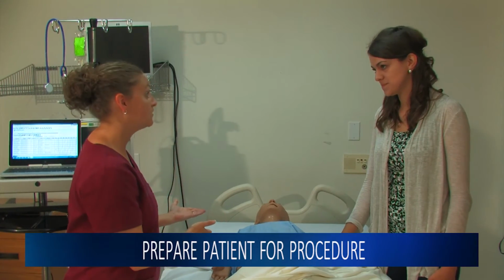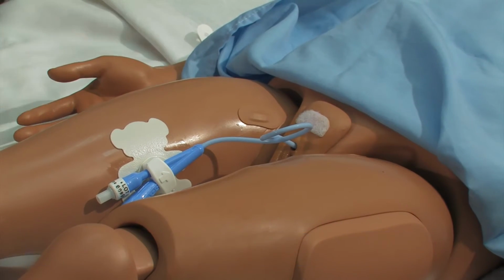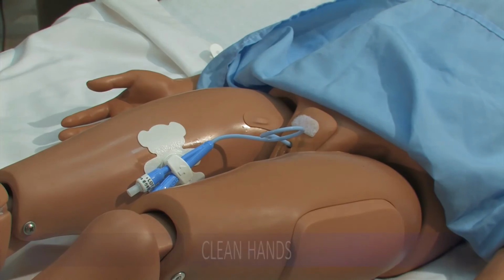Prepare the patient for the procedure. Make sure the catheter is secured to the patient's upper thigh. Allow enough slack so that there is no tension on the catheter with leg movement. Use of a securement device is preferred.